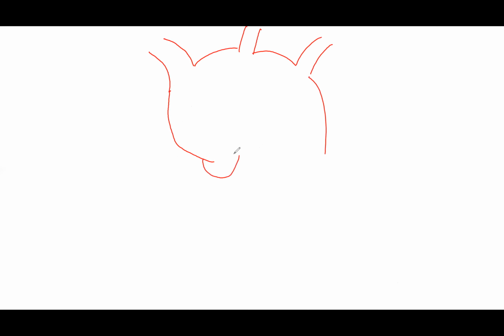And then this is the aorta. Okay. So right is coming out here, left is coming out here. And then you're looking for the grafts on the anterior aspect somewhere here. And I told you about the different, this is how I'm looking at it in a sequence.